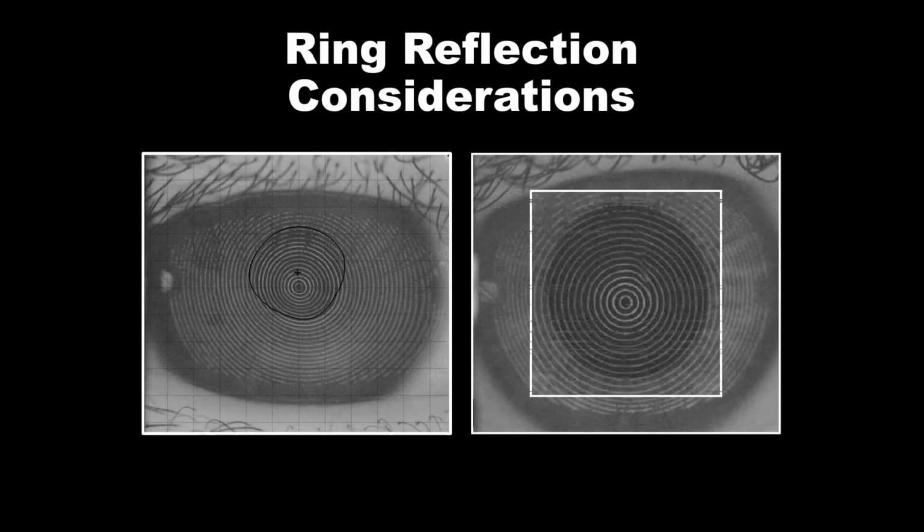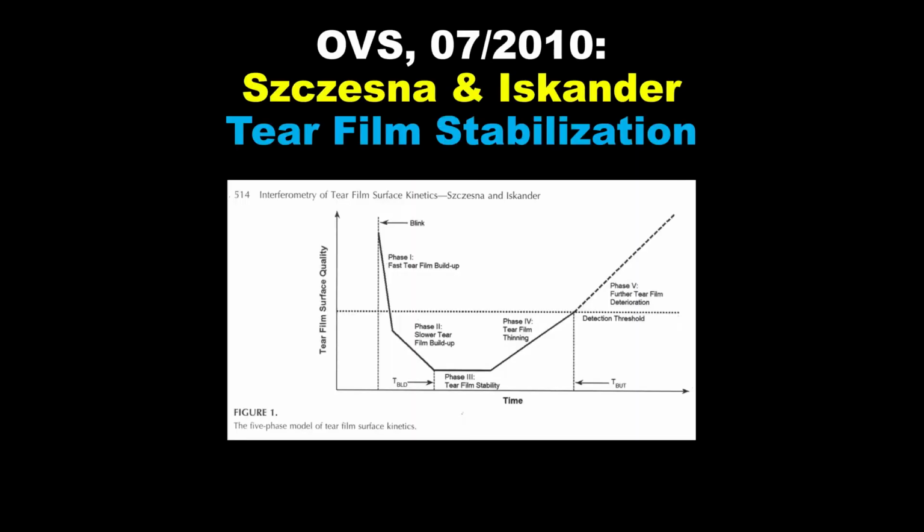Well, let's blow that up. And if we zoom in, you'll notice that multiple rings have begun to break. And it's the central 10 to 15 that are most important for determining the entire corneal topography. So be very critical of your central rings.